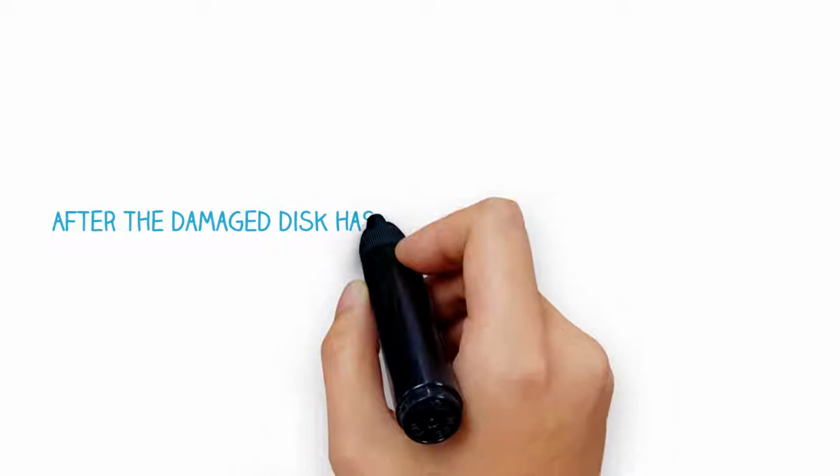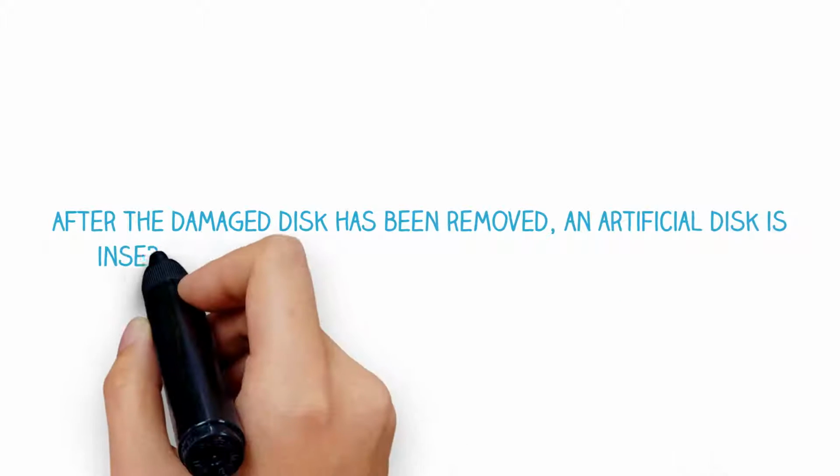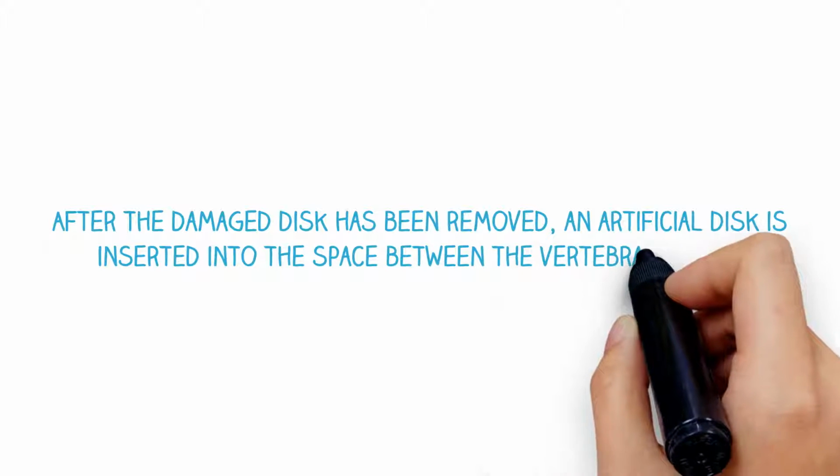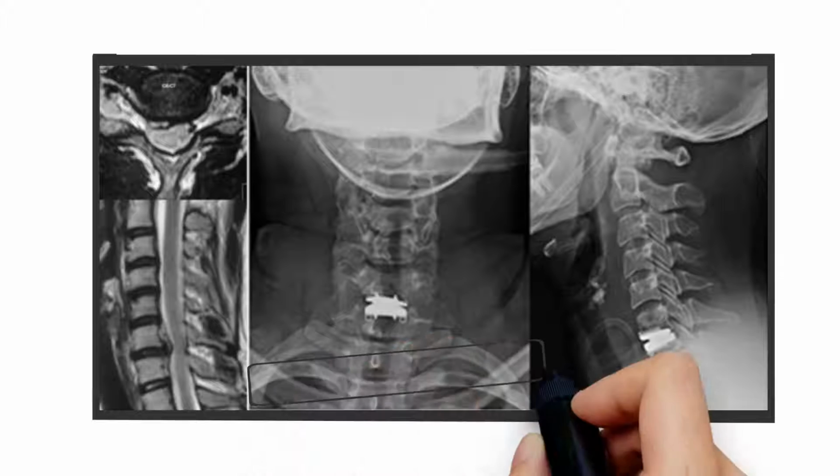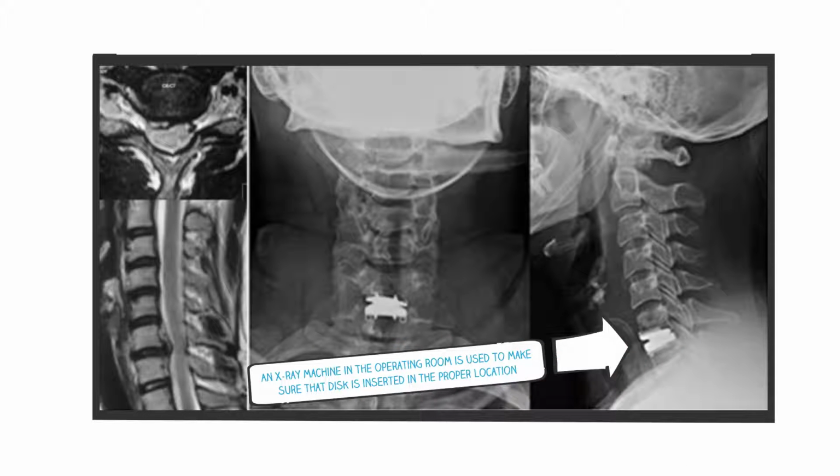After the damaged disc has been removed, an artificial disc is inserted into the space between the vertebral bodies. An X-ray machine in the operating room is used to make sure that disc is inserted in the proper location, and the range of motion of the cervical spine is preserved.